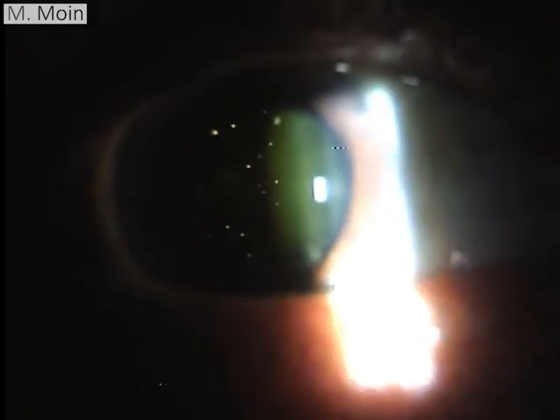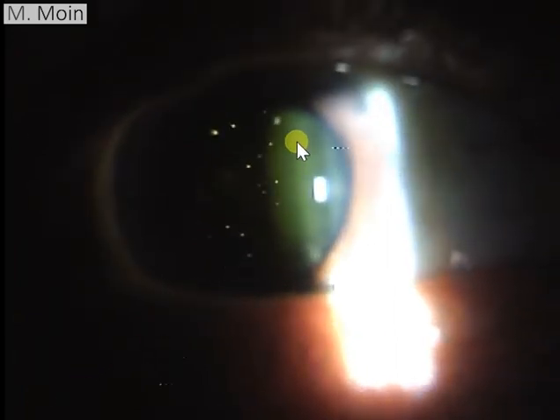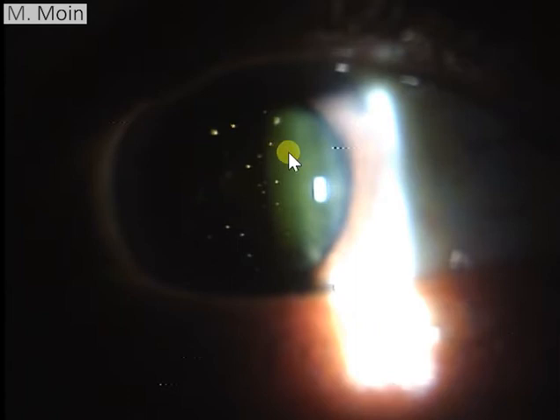As you would see through an anterior segment examination without a Volk/indirect lens, here you can see those particles and they will move when you move the eye. You can see the anterior one-third of the vitreous on straight-line examination and you can see these particles.